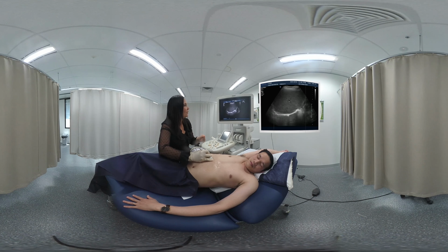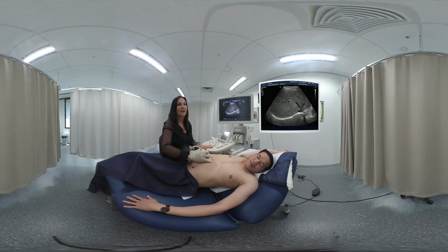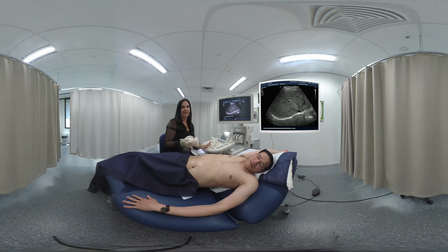So here we have our portal vein again. Once again, portal vein, hepatic veins, remember they don't have echogenic walls. Big breath in, patient. So they don't have echogenic walls like the portal vein, so that's how we differentiate them. So middle hepatic divides right and left, and we've got the right hepatic, left hepatic vein there. So that's the basics of liver anatomy and scanning.